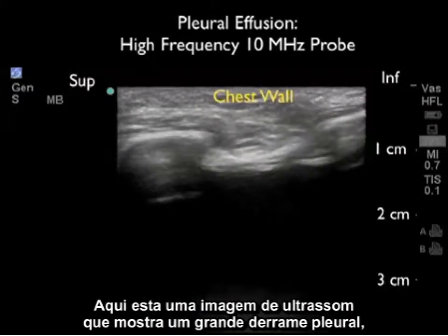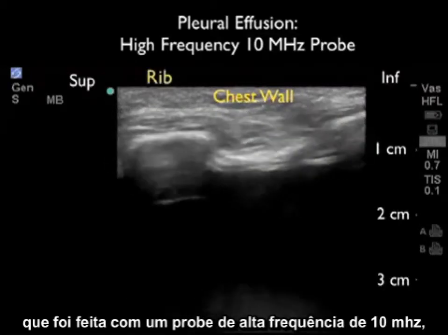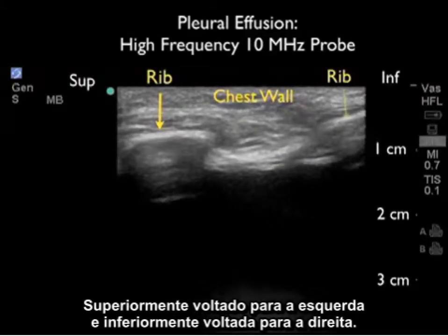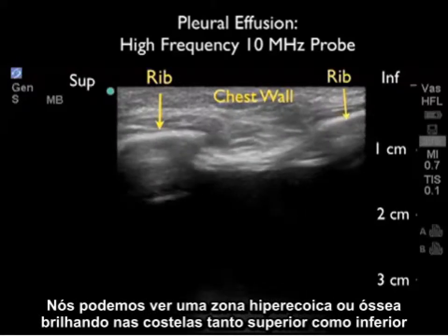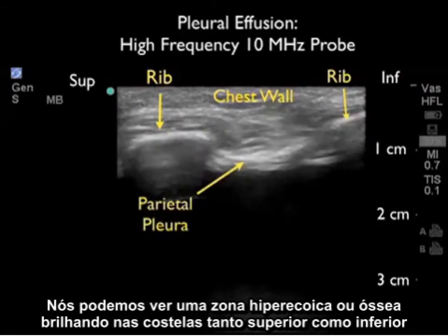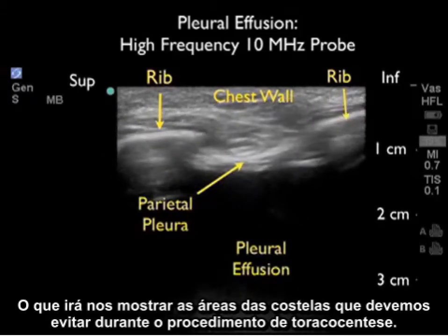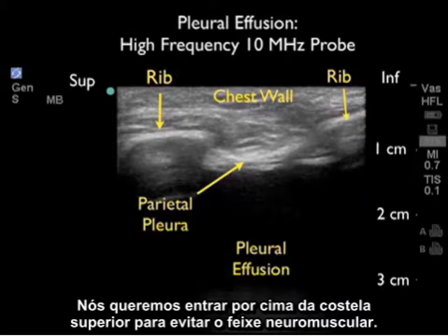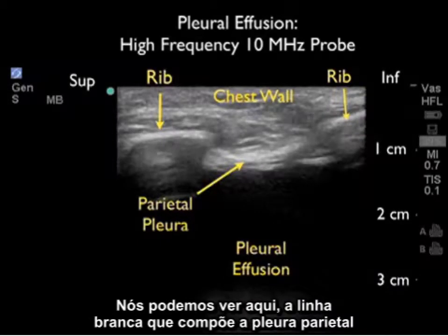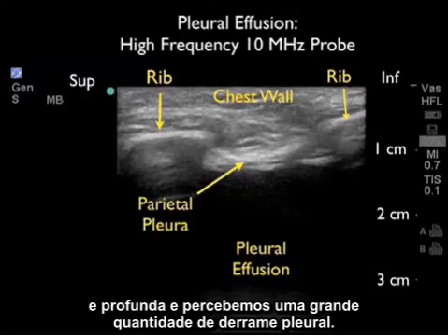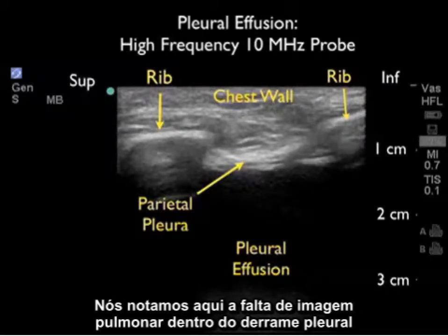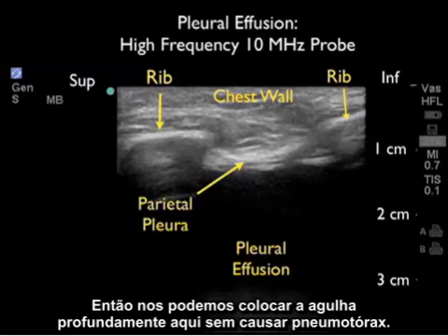Here's an ultrasound image of a very large pleural effusion taken with a high-frequency 10 megahertz probe, with superior towards the left and inferior towards the right. We can see the hyperechoic or bright bone tables of the rib, both superior and inferior, showing us the rib areas to avoid during thoracentesis. We want to come in over the top of the inferior rib to avoid the neurovascular bundle. We can see the white line making up the parietal pleura, and deep to it a large amount of pleural effusion. Note the absence of lung within the effusion, so we could place the needle quite deeply here without causing a pneumothorax.